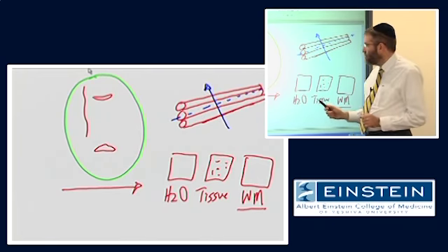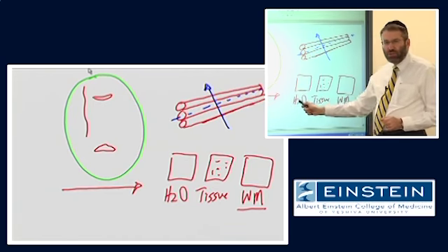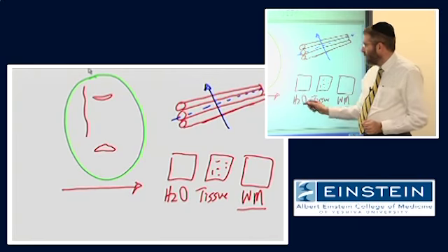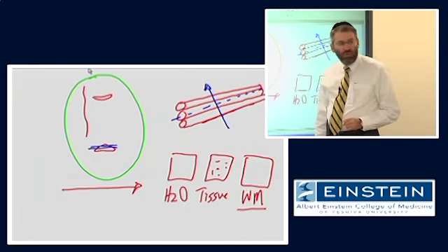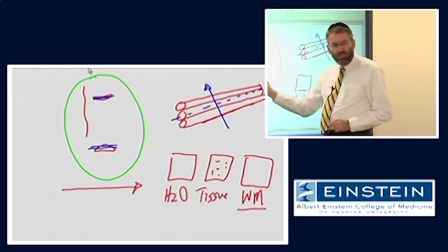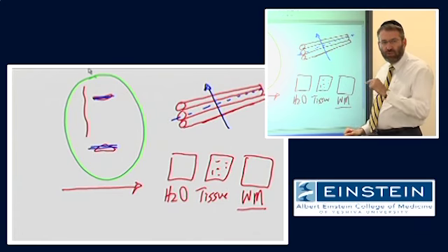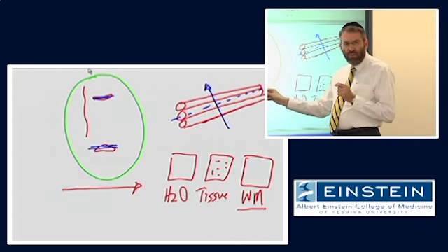That's why if I generate an image over here, which is sensitized to diffusion in one direction only, left to right, the orientation of the fibers, corpus callosum fibers moving left to right in the brain, there is a large amount of diffusion along the length of those fibers and relatively little diffusion perpendicular to those fibers.